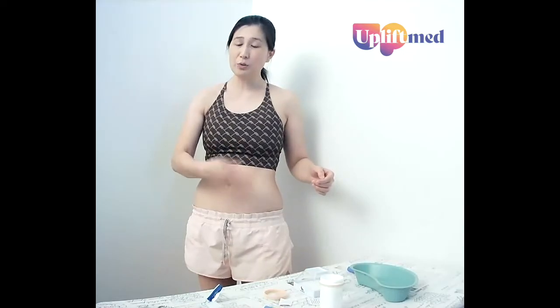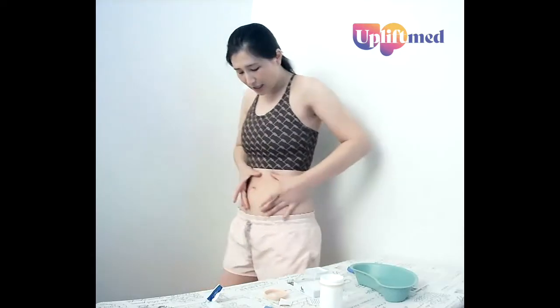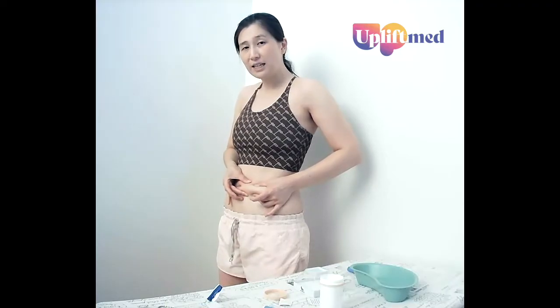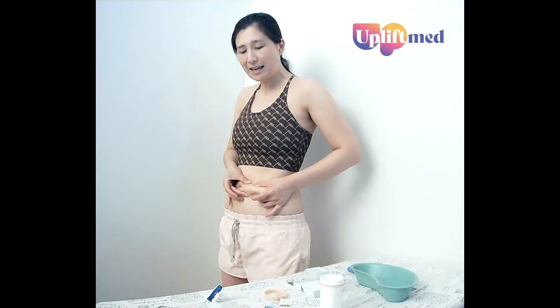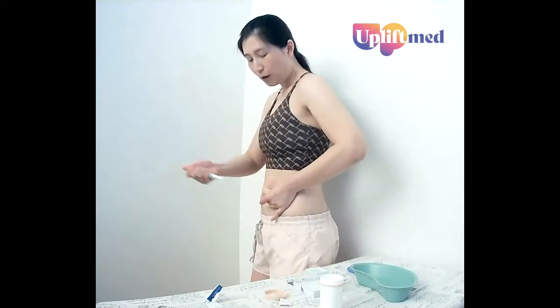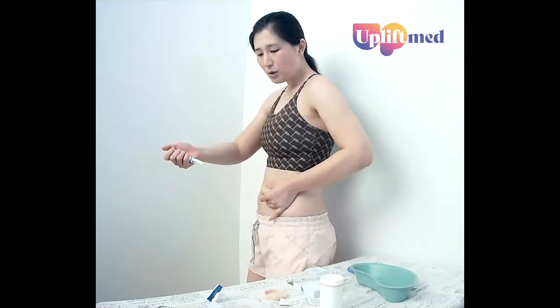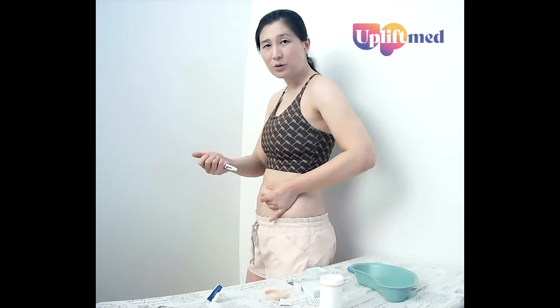The next thing we're going to do is get our fold of skin ready. You can grab the fold of skin so that you can be sure you're simply injecting into the subcutaneous layer. When injecting, you want to make sure that you're injecting perpendicular to the fold of skin. You don't want to be injecting on an angle, and you also want to go in and out perpendicular. Don't go in, give it a jiggle, and go out on a different angle, otherwise the needle is going to bend and scratch you.